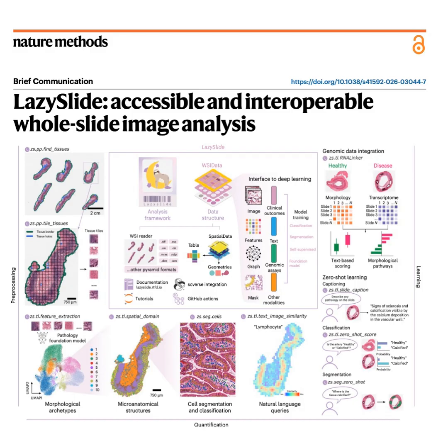Right. And the existing spatial biology toolkits that try to parse these images, I'm thinking of software like QuPath or CLAM or PathML, they rely on these really fragmented data structures. Yeah, they do. If you're a genomics researcher working in standard molecular frameworks, you can't just plug an SVS file into your workflow. Right. And previous attempts to force this integration were technically pretty flawed. There was this extension called SOPA, right? It tried to bring spatial visual data into the molecular ecosystem. Yeah, but SOPA operated by forcing users to serialize and physically duplicate these massive WSI files just to append the genomic metadata. And the disk overhead for that was just catastrophic, wasn't it?